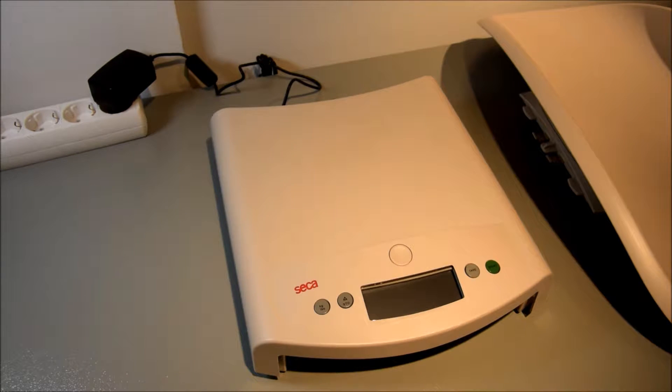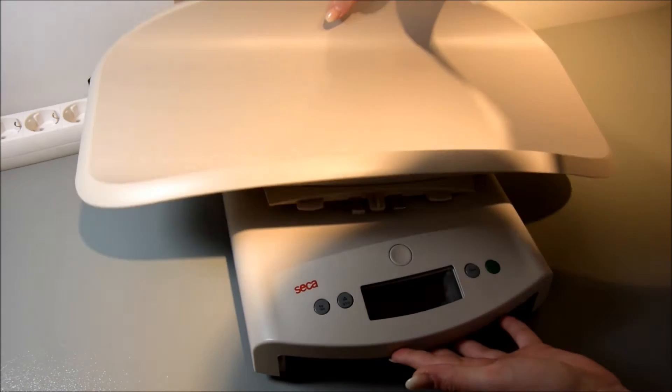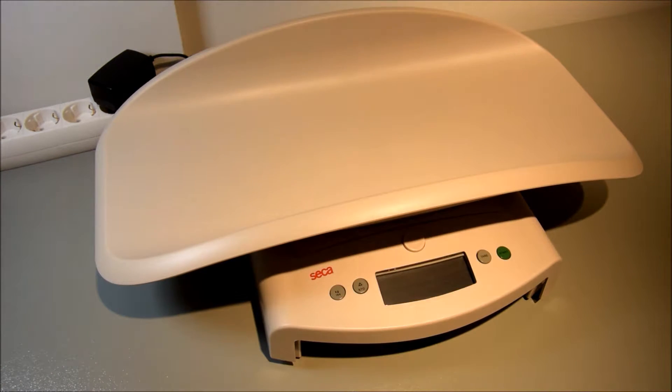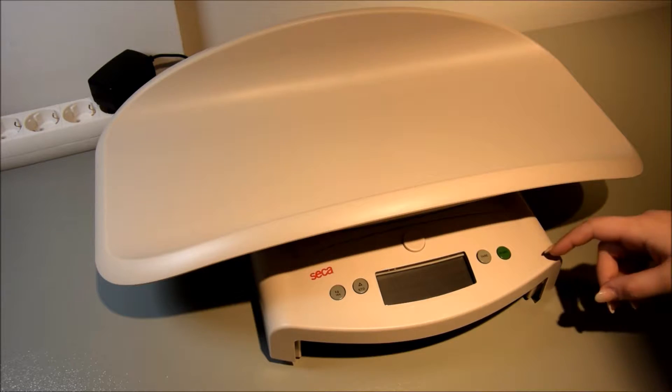In the next step, position the tray on the base of the scale and pull it forward until the tray snaps into place. To use the scale, switch it on by pressing the green start button.